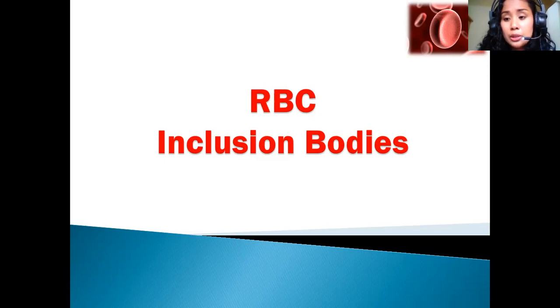Normally, it should be anucleate, walang nucleus. Dapat wala ring nakikitang remnants of RNA or DNA or iron. Dapat wala. But in some cases, in certain diseases, meron, guys. So we call it inclusion or inclusion bodies. So let's discuss it.